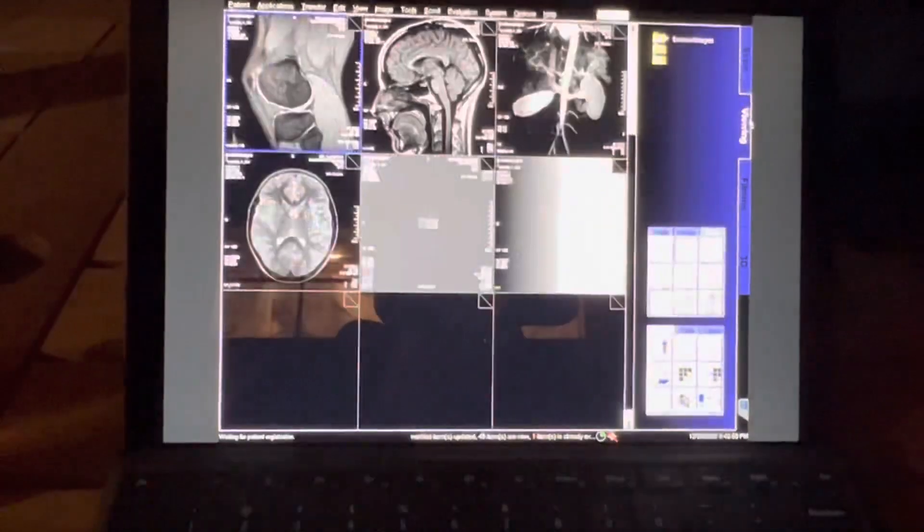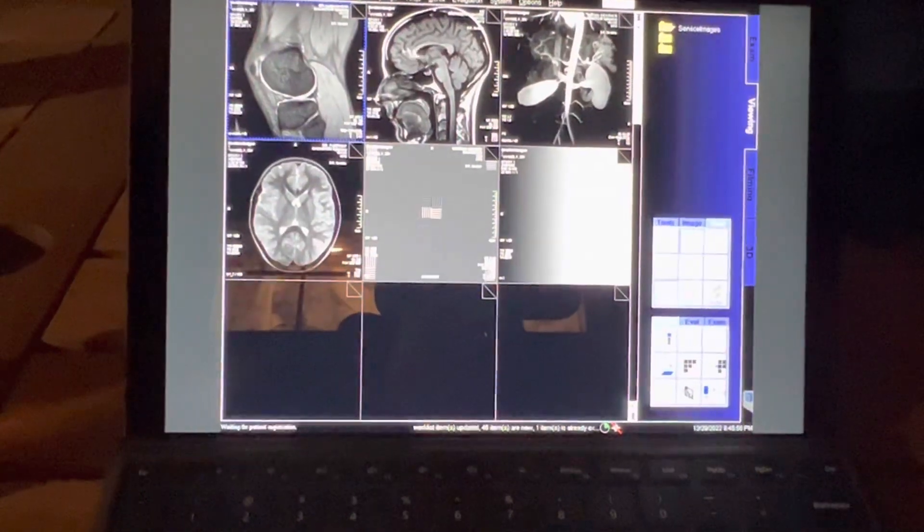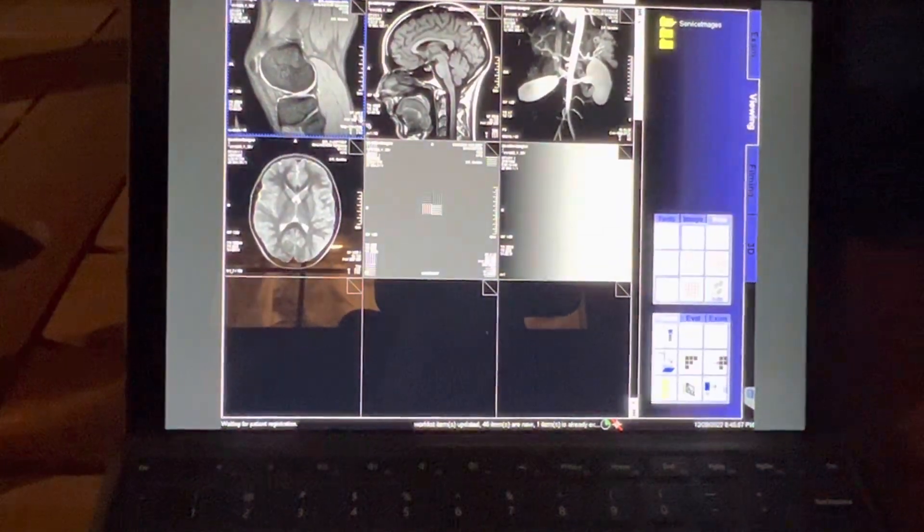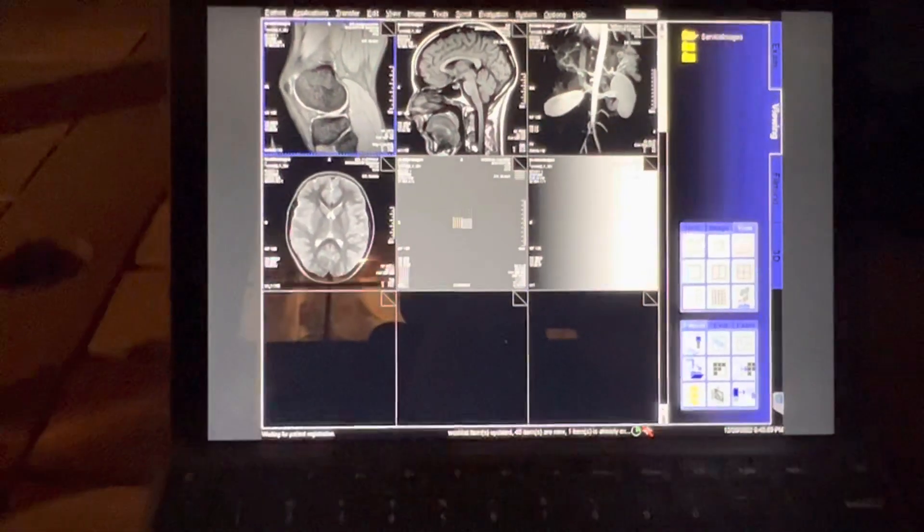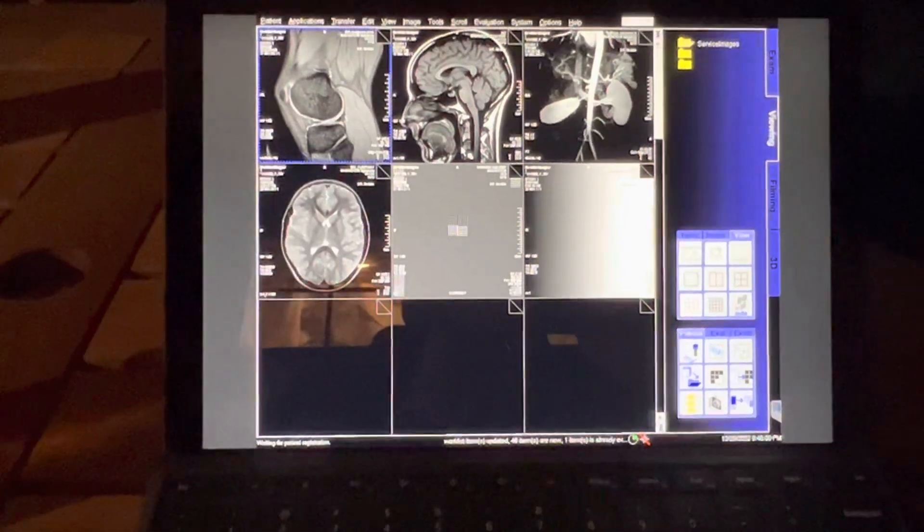So click on the Viewing tab, we can see them all. There you go.